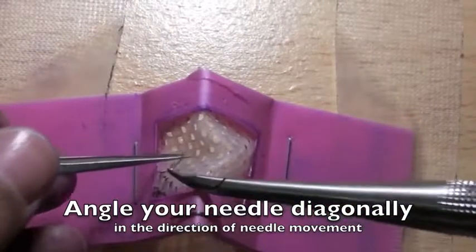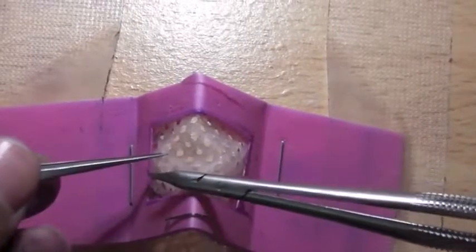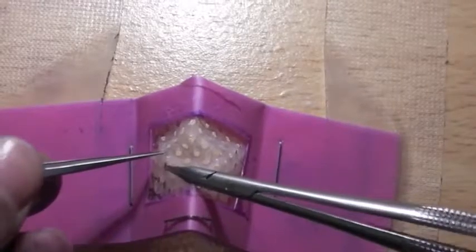Going backhand is far more tricky because you're going backhand and diagonally. Have patience — you will get there in the end.